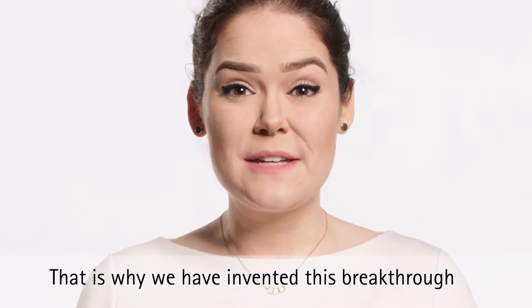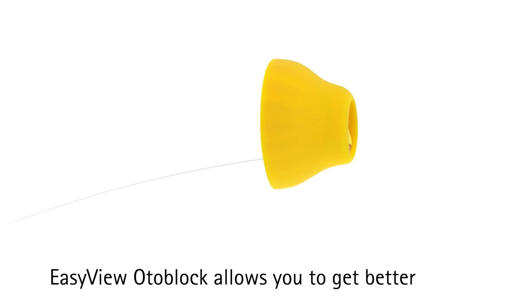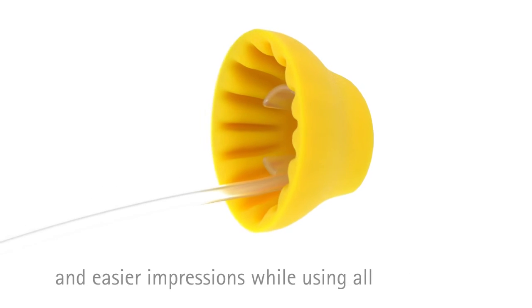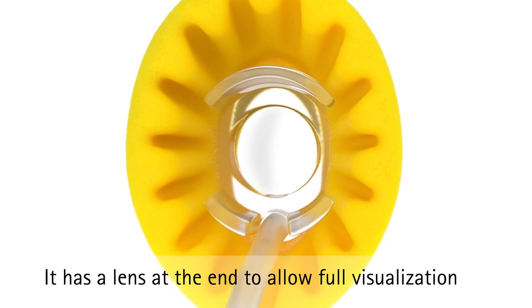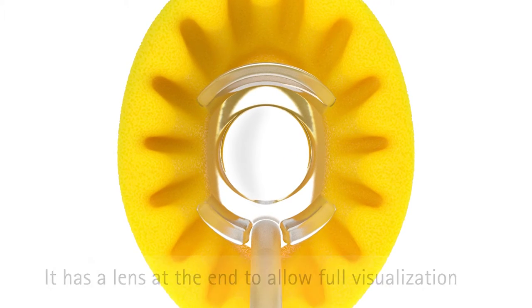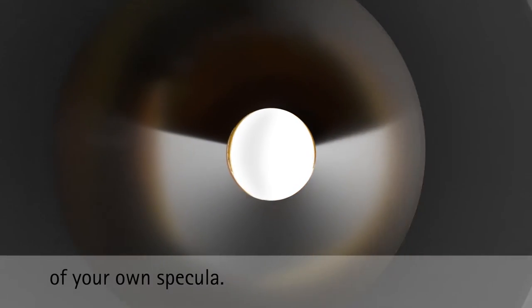That is why we've invented this breakthrough in impression taking: the EasyView OdaBlock. EasyView OdaBlock allows you to get better and easier impressions while using all of your standard impression equipment. It has a lens at the end to allow full visualization during insertion and slides right onto the end of your own specula.